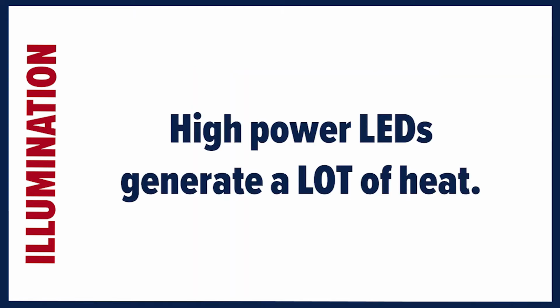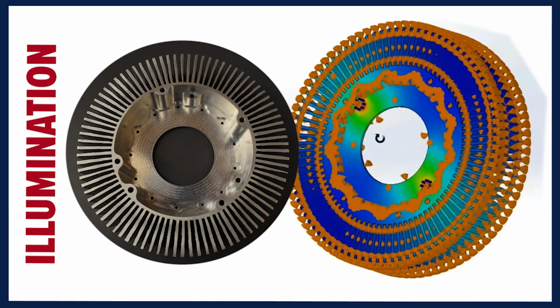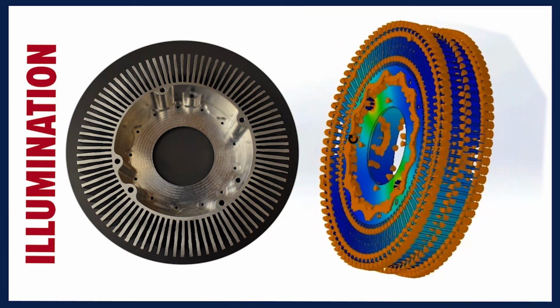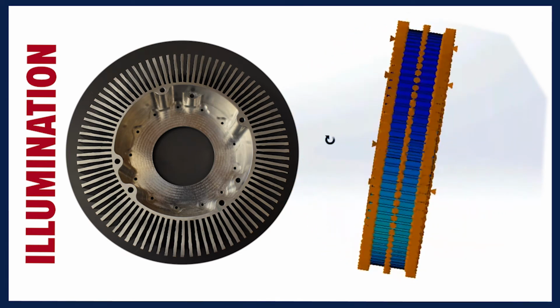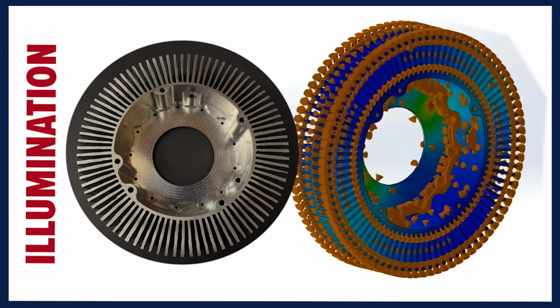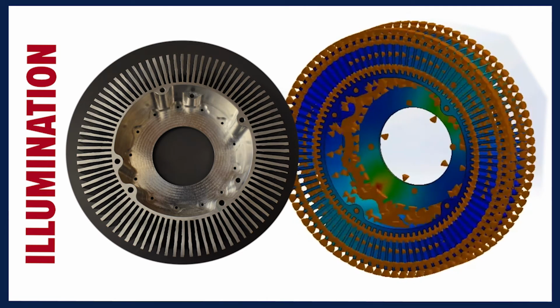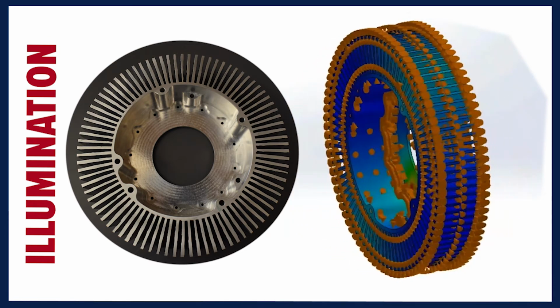per second. The LEDs chosen for our project are high power and dissipate a considerable amount of heat. The heat generated by the circuitry was modeled extensively during the project's development, and in order to prevent any damage to the system that could be caused by this heat, the team designed an aluminum heatsink that effectively pulls heat away from the 2 PCBs and expels it into the system's surroundings.